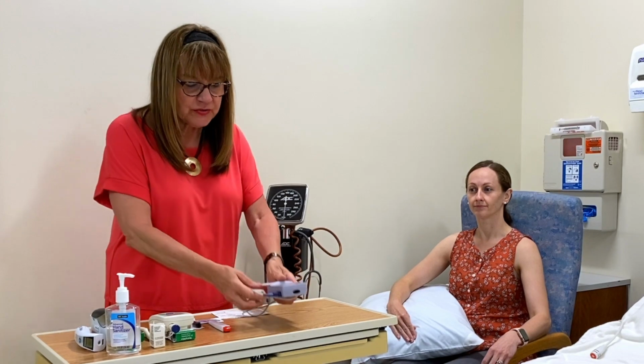The other thing we're going to be doing is an SpO2 measurement. This measures the amount of oxygen that's circulating on your hemoglobin molecule.